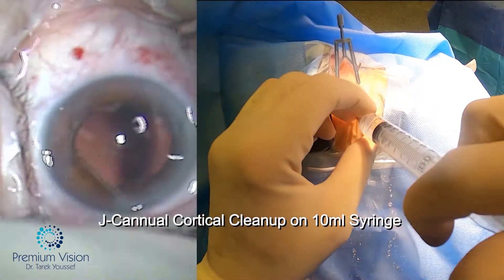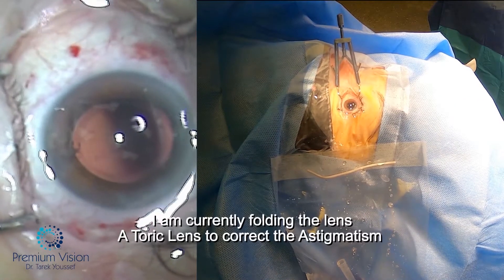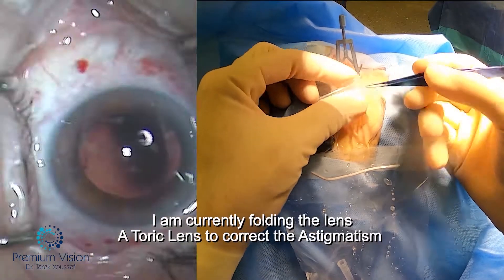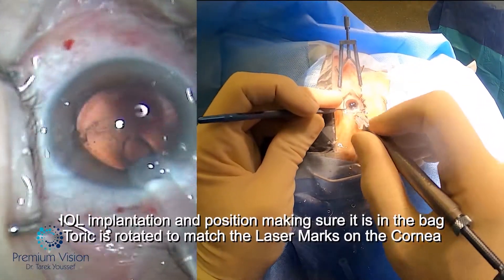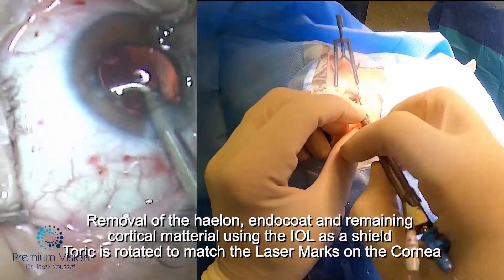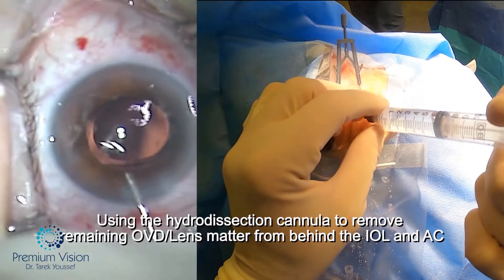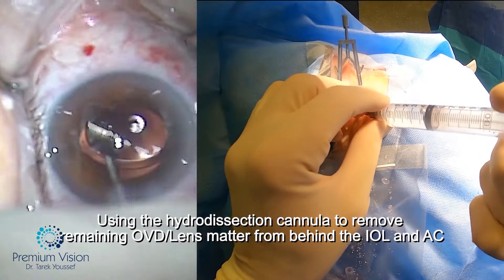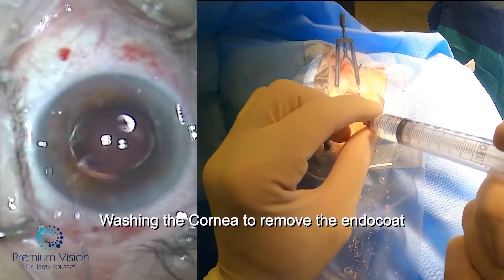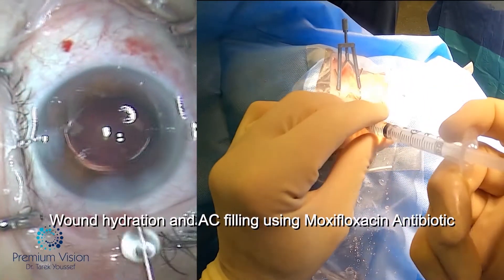All the material is pushed out through the wound — I don't have to do suction until we implant the lens. The lens is a toric lens to correct astigmatism. The laser has marks on the cornea that are not very visible in the microscope but I can see them in real life. The lens is folded, implanted, and rotated into position while I'm doing irrigation aspiration to remove all the material, hydrating the wound and washing behind the lens with the irrigation cannula, then hydrating the wound with antibiotics to seal the wound and protect against endophthalmitis as part of the dropless injection system.